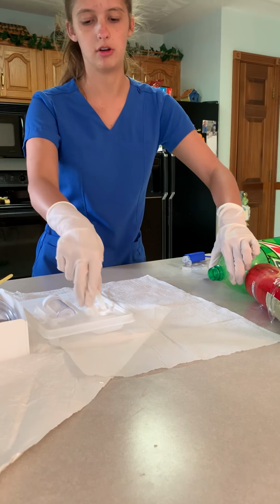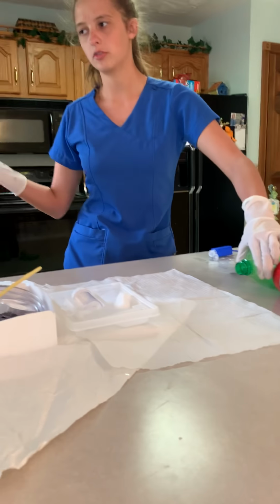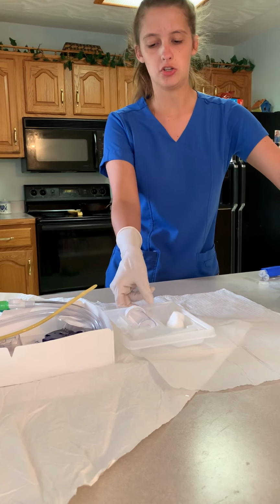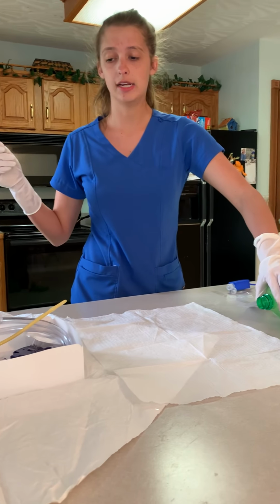And then we will just rinse off any excess. We're going to go out and away. Okay, I don't need these anymore, so I'm going to go out and throw them away. And I don't need my tray anymore, so we're going to go out and away. Okay, so now we're ready to insert the catheter.